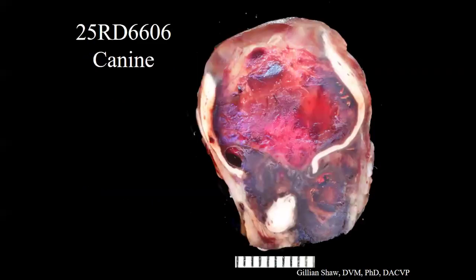Alrighty, next up. We have an eye from a 4-year-old French bulldog. It came with a history of corneal rupture and crushing trauma. And they say upon enucleation, a large black mass was noted around the optic nerve and extended into the caudal orbit. Their differential was necrotic tissue hemorrhage versus melanocytic neoplasia, which is common grossly and apparently surgically when you can't differentiate between an actual melanocytic neoplasm, which is very dark brown, and hemorrhage, especially older hemorrhage when it's more organized, which can also be very dark brown.